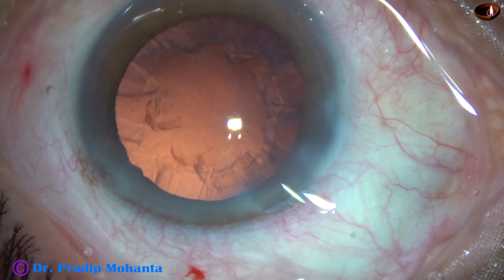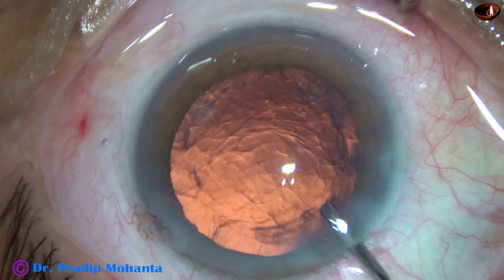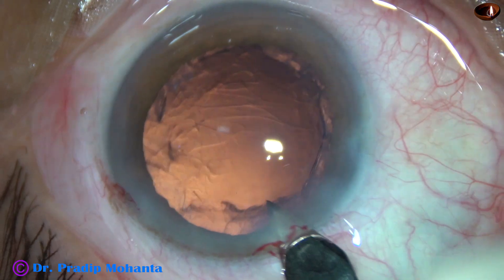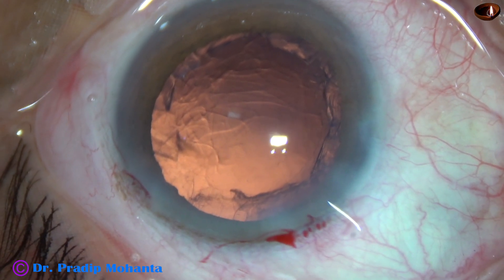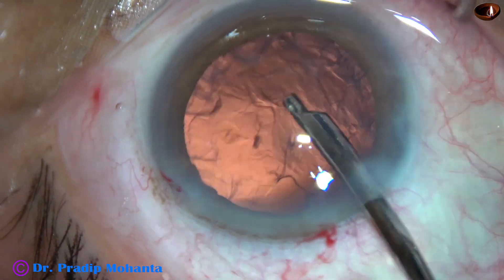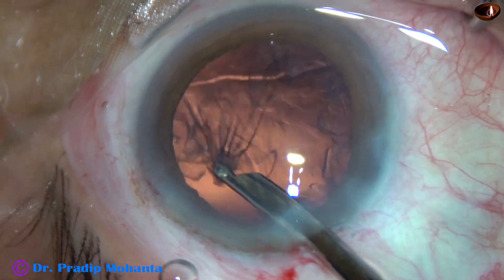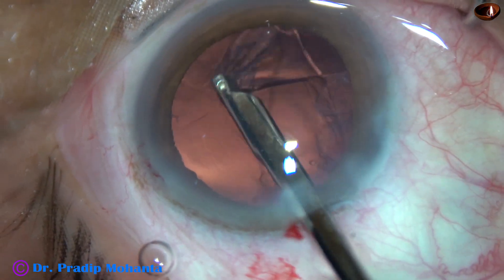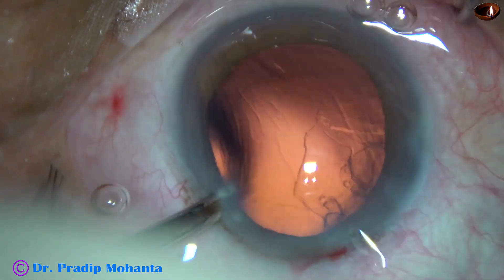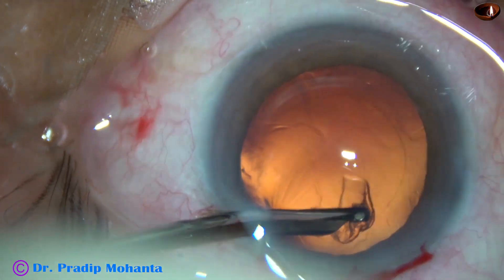Friends, this is a totally unedited recording and you are watching each and every step of the surgery. Some viscoelastic is injected into the anterior chamber. In this case I am going to use a B-type IOL, so I want to enlarge the main wound a bit — the 2.8 mm incision becomes about 3 mm. Cortical cleanup is done with this instrument — this is a 23G Simcoe cannula. See how beautifully you can remove the cortex. While removing the cortical lens matter, we must hold the anterior part of the cortex — that is, the part which is just under the anterior capsular rim. The cortical lens matter from 10 o'clock to 12 o'clock is removed going through the side port.